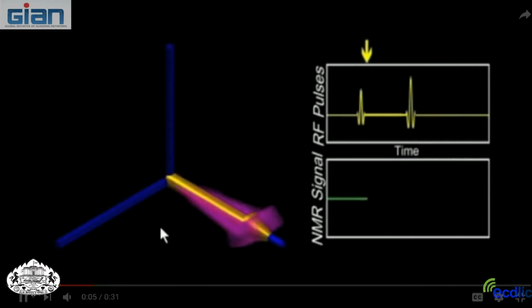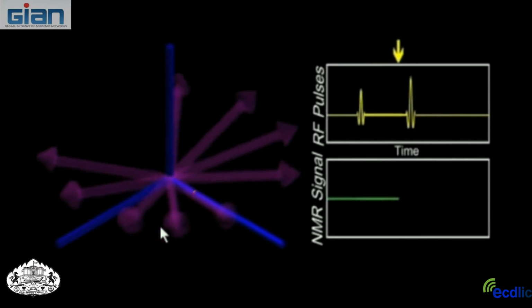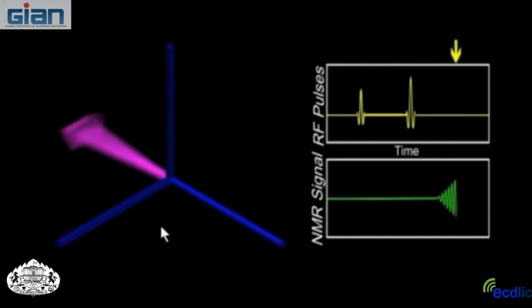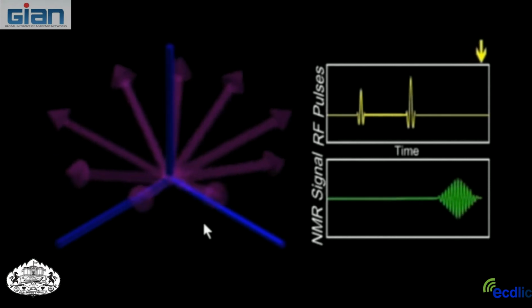We apply the pulse. So that is spin echo.